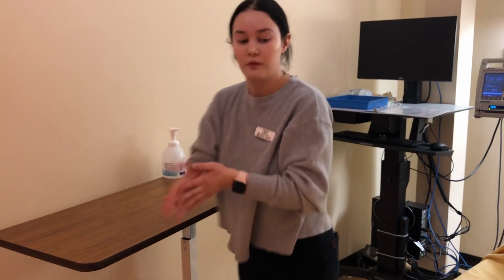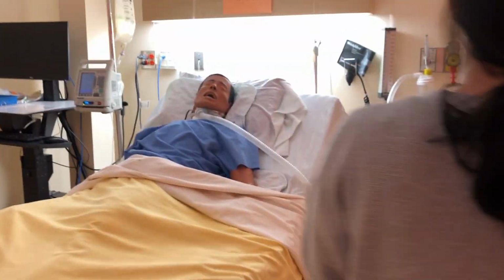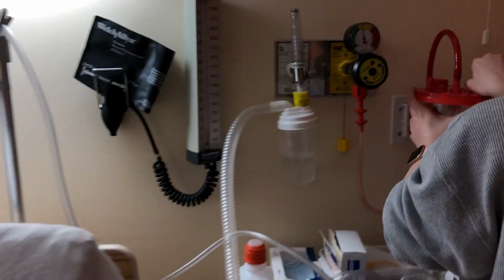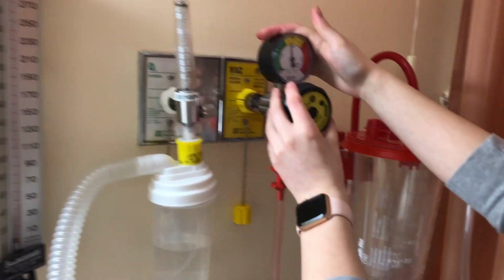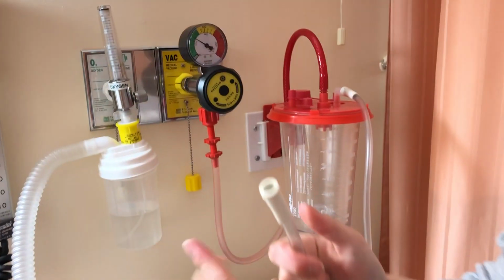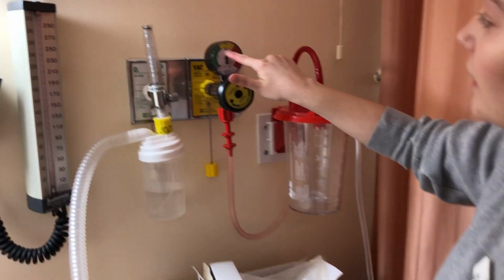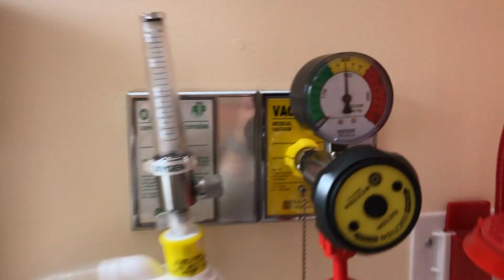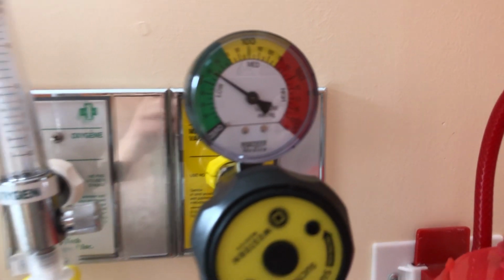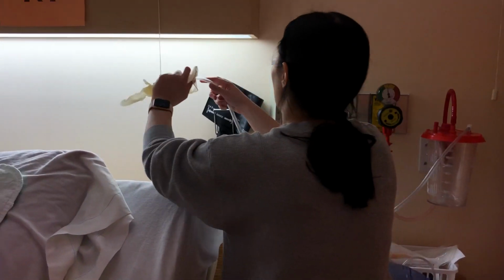So I'm just going to perform hand hygiene again, and I'm going to perform my safety checks. So here I'm making sure that everything is connected. I'm making sure that my suction, so I have my suction here. I'm making sure that when I'm actively suctioning, it's within the 80 to 120 range. So it's at 100 right now when I'm actively suctioning. Okay, I'm just gonna return a glove.